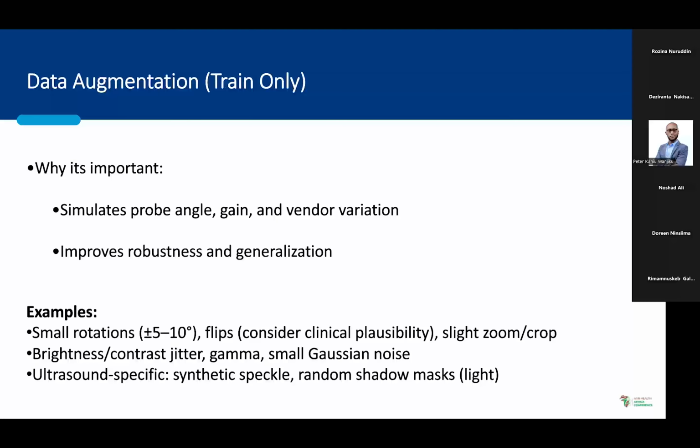Another thing you could do during pre-processing or during model training is data augmentation. When you take data from ultrasound devices, you have a fixed data size of ultrasound images or videos, but you have unlimited settings. So in actuality, the variation in the real data could be very high, and that is often not captured with a limited size of data. So you could do manual data augmentations to simulate some of that diversity that can happen in real testing.